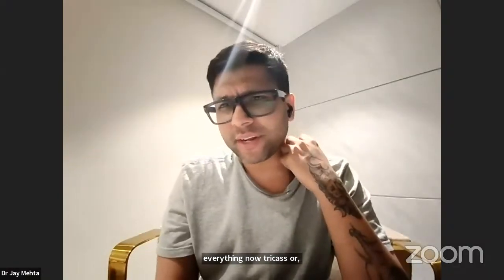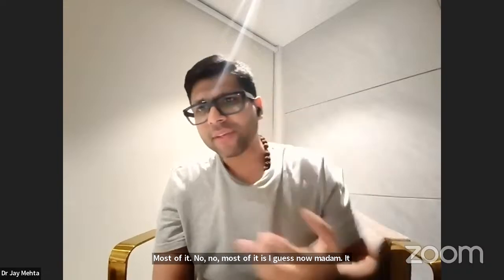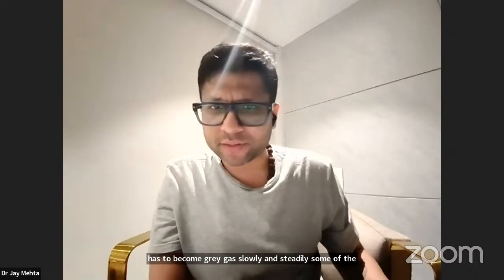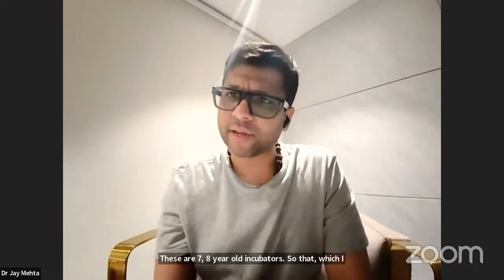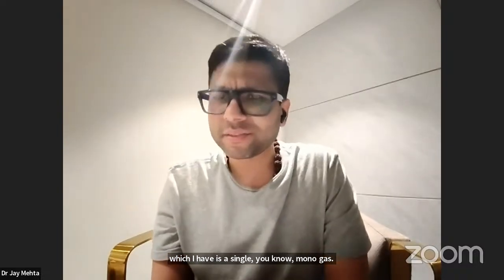So between the tri-gas and single gas, is everything now tri-gas or do we still have both? No, most of it is tri-gas now, madam. It has to become tri-gas slowly and steadily. Some of the incubators which I showed are from my laboratory. These are 7, 8 year old incubators. So that Hera cell which I have is a single gas, monogas. But as I said, now even the box type incubators are available as tri-gas.